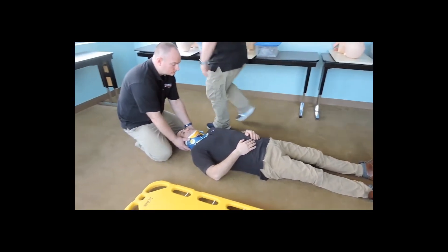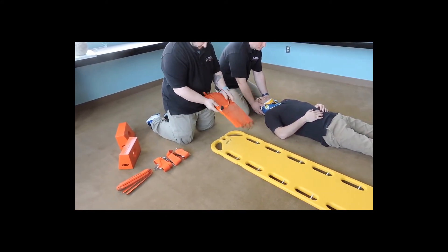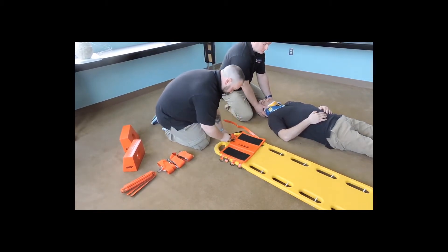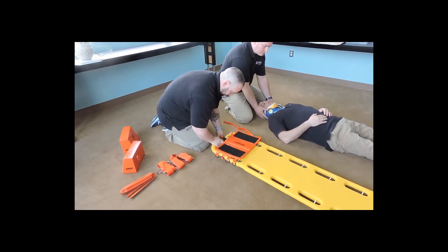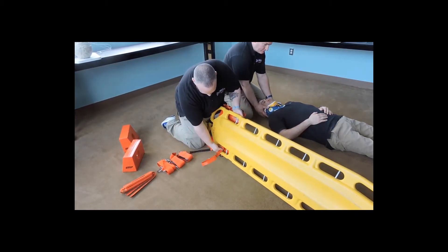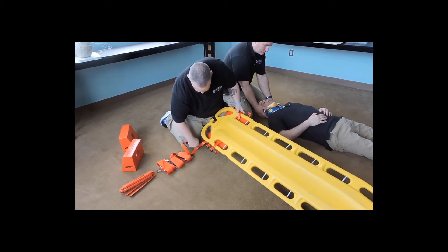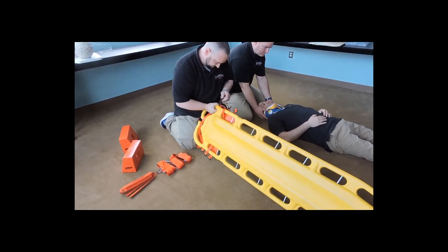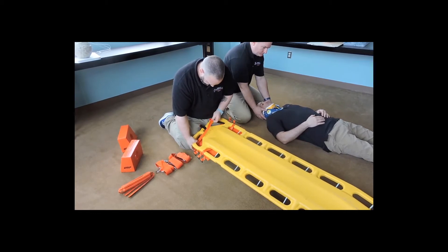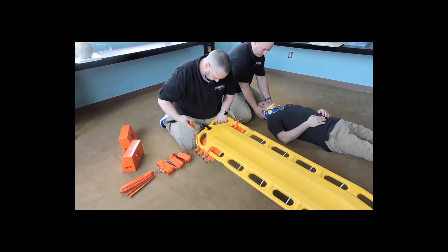Maintain C-spine for me. I'm going to set up the board. I'm going to attach my head bed to the long board and secure them through the loop. Take my board away from the patient. I'm going to feed my straps through the back, making sure there are no twists. Once we have it secure in place.